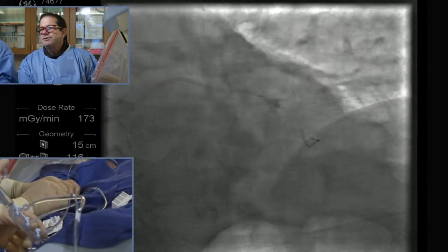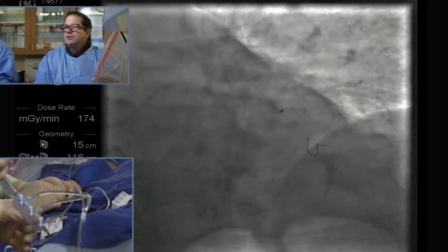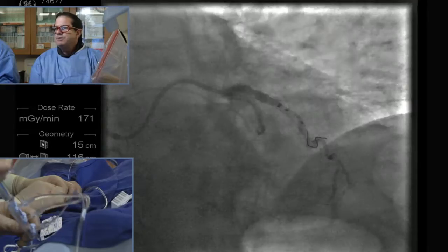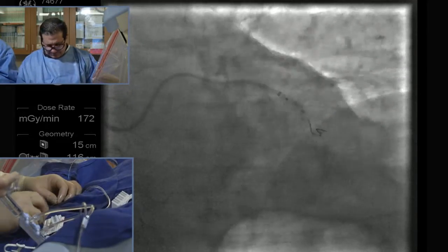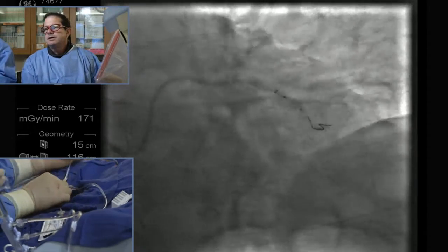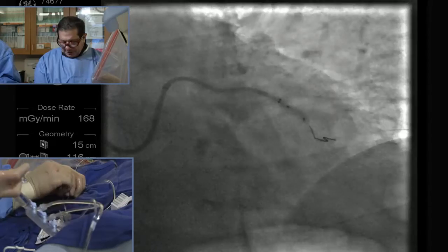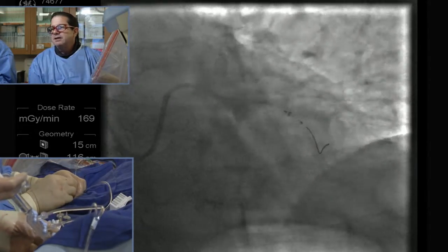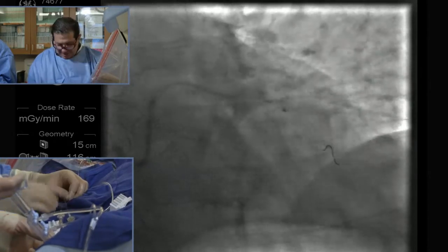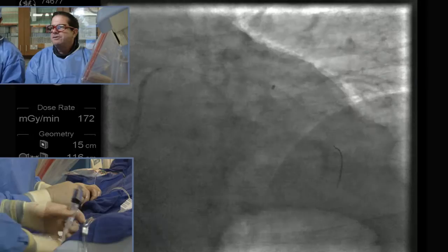At Scripps, are you guys seeing more complex PCI cases over the last year as opposed to three or four years ago? Actually, I think I have just the opposite happening. This is getting out there now — a lot of people are doing it. I get the cases referred to me, like this one. I've trained 70 fellows now, so they're out there and they're pretty competent to do this kind of stuff. I like to keep these stents not hooked up because I'm superstitious.